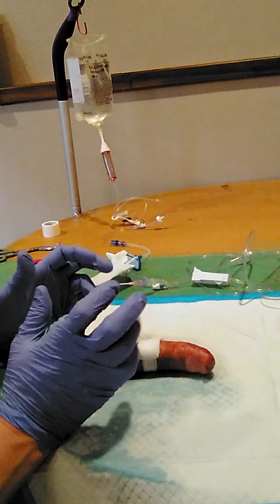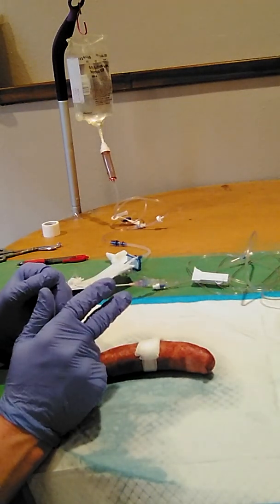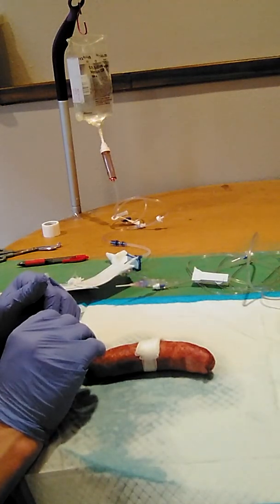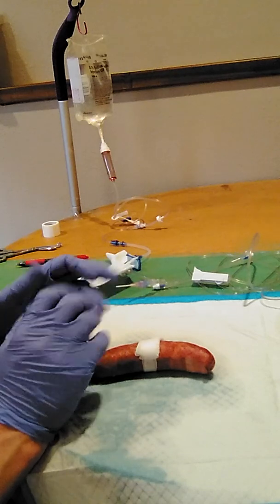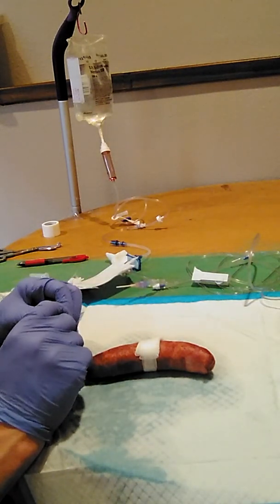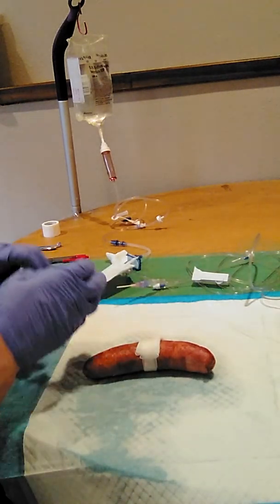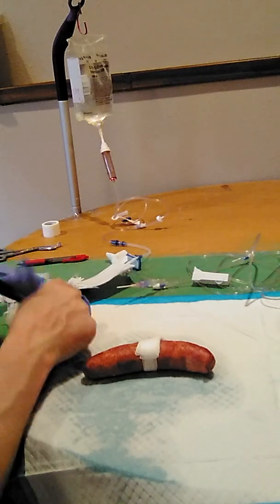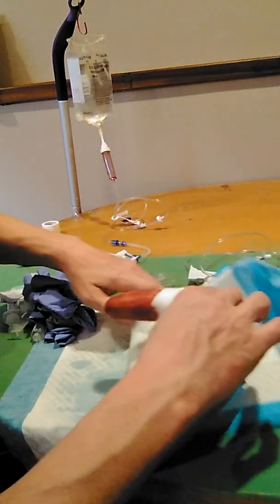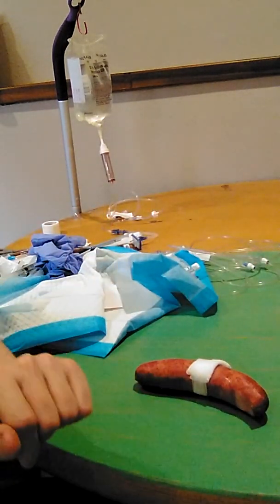Now, I'm going to document everything in the medication administration record, my name, what I did, what time I began, what time I ended, the site, the patient, any complaints or feedback I've gotten from the patient. And that concludes my discontinuing an IV infusion for my return demonstration. Thank you. I'm going to perform hand hygiene before I leave the room and clean up all my things. Leave the patient in a comfortable position, lowest position possible with their bedding, and that is my conclusion.